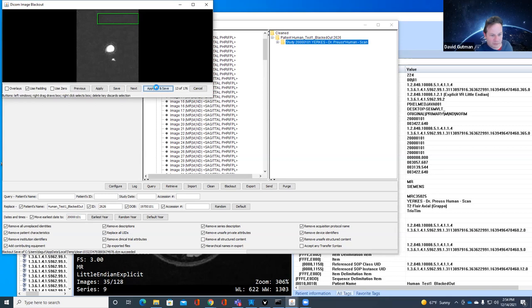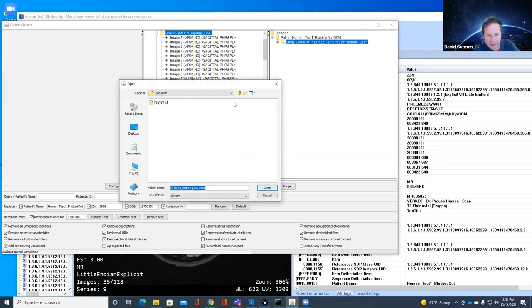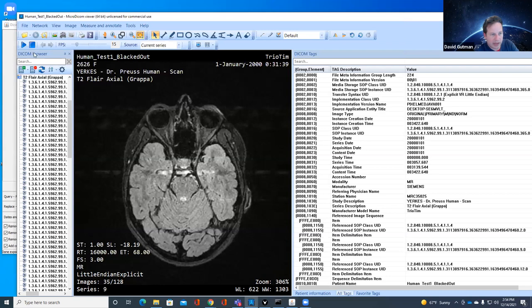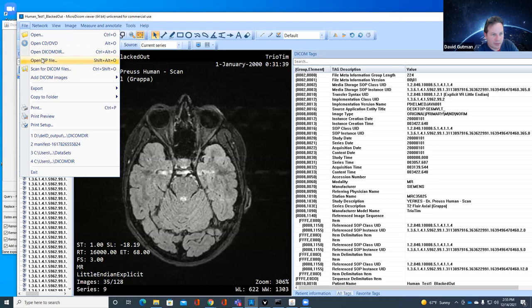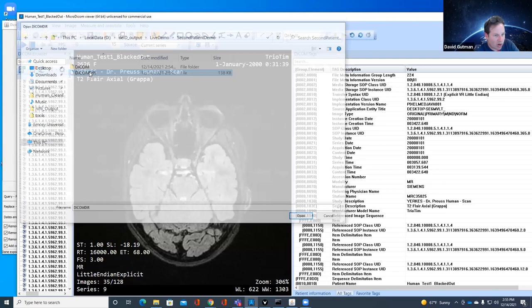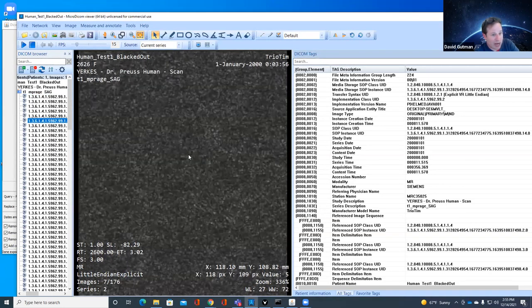I'll draw my little square and hit apply and save. I wait not very many seconds. I export it again to the live demo folder. Then I open a DICOM directory to verify. Even if you're doing this manually, this isn't a crazy amount of work if you have small hundreds of scans — this is a tractable problem.